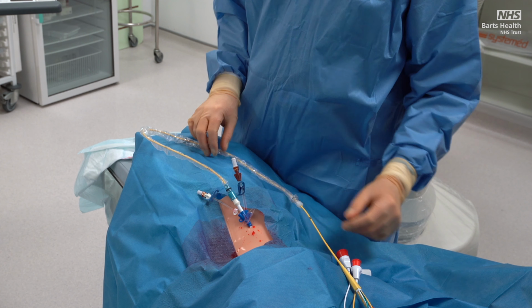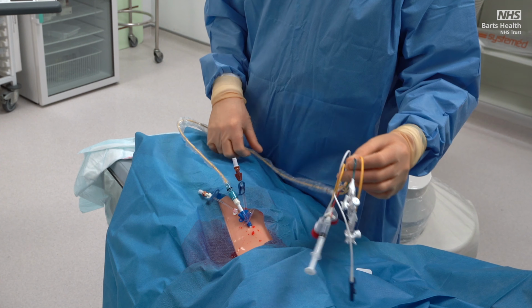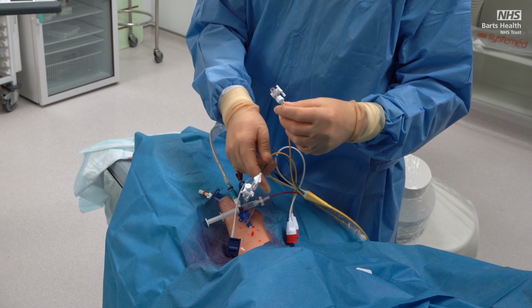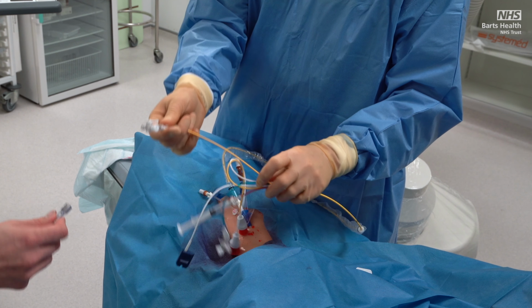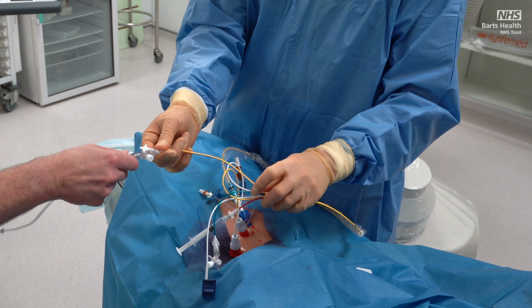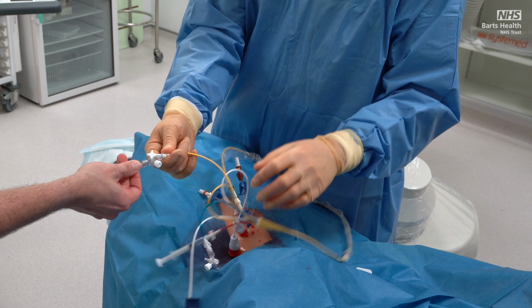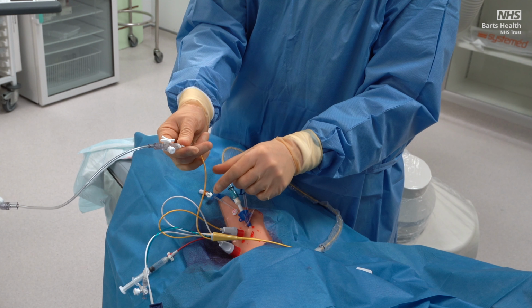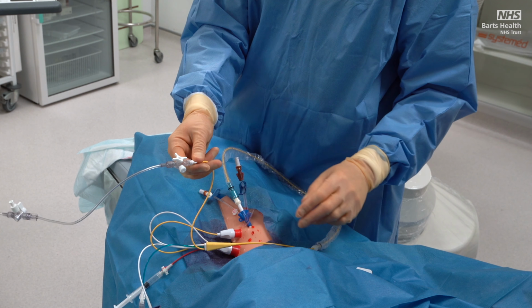Ask an assistant to help you to connect the primed pressure transducer to the yellow lumen, such that you remain sterile. Open the three-way tap if it is locked, so that the pressure will be able to be transduced, and ensure you can see the monitor.